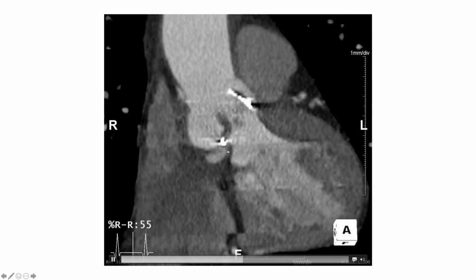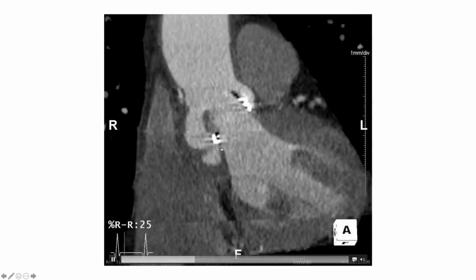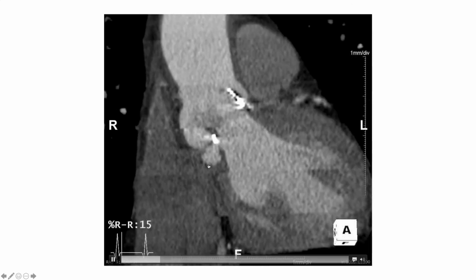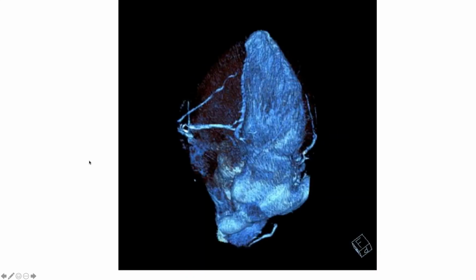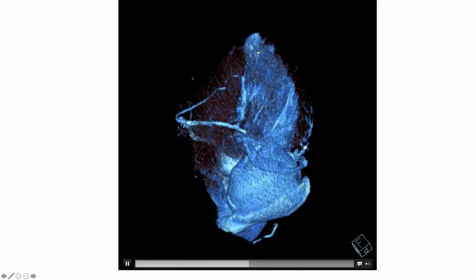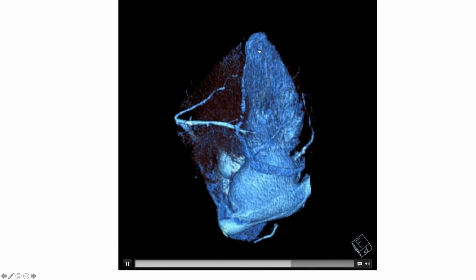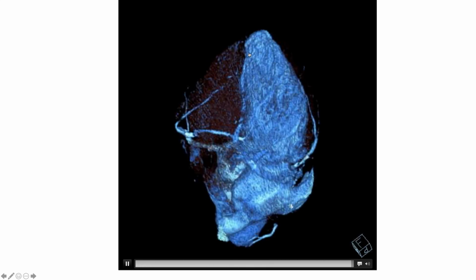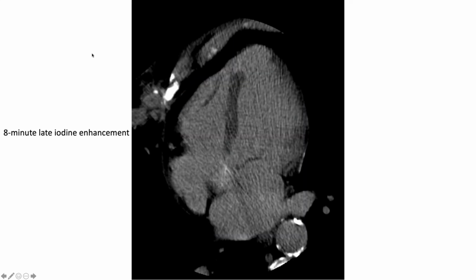I didn't mention that it's unfortunate that we don't do any more T2 weighted imaging. We just do mapping. Mapping was abnormal in the areas of enhancement. T2 was elevated, and of course T1 and ECV were elevated in the areas of enhancement. But I used to really like seeing the T2 weighted images in the presence of inflammation or edema. Have you abandoned doing T2 weighted imaging too to speed up your studies and just do mapping? No, we use both.